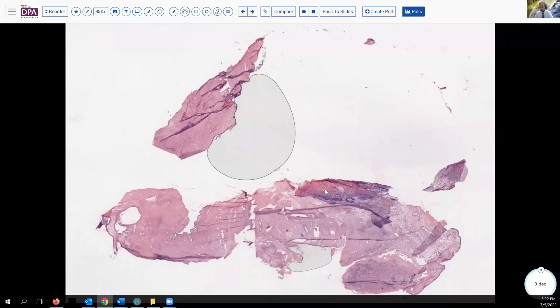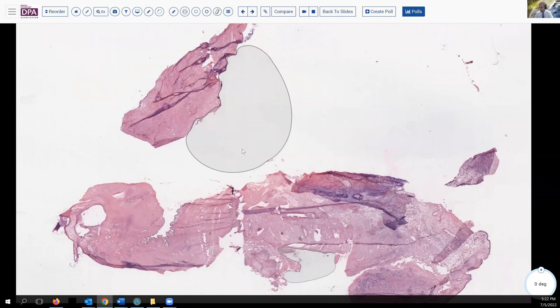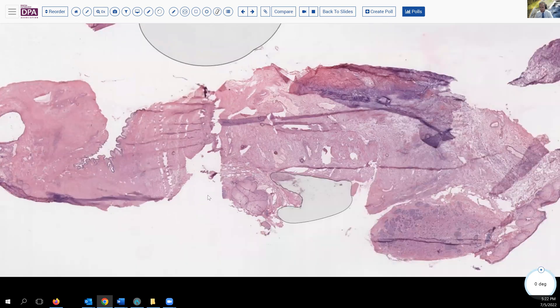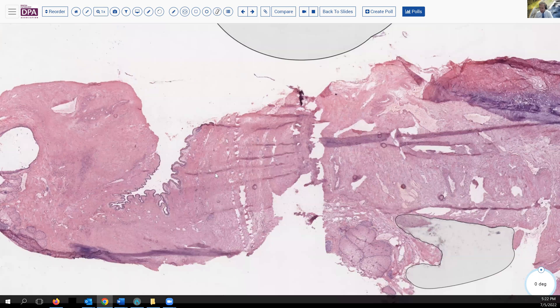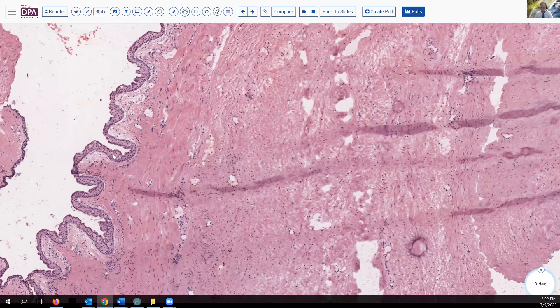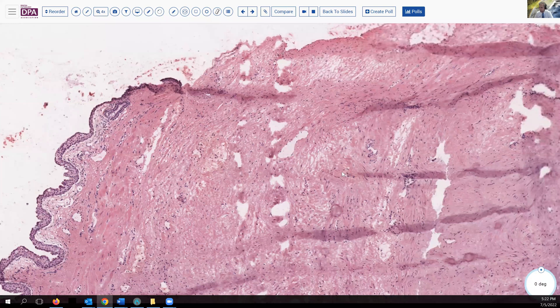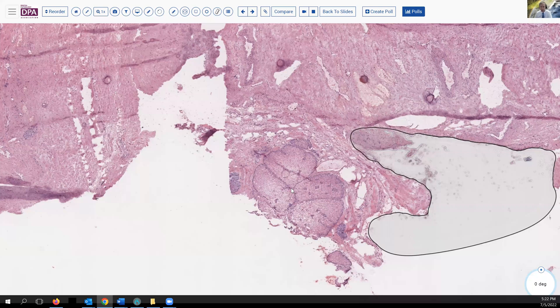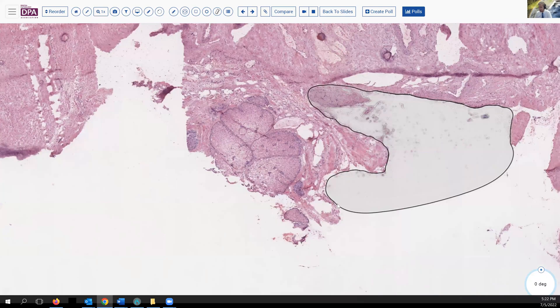Not having a histologic diagnosis, they brought the patient to surgery and submitted this tissue for frozen section. As you can see, we froze and included a couple of little bubbles to make life more interesting. But right off the bat, we said this looks like a teratoma because much of what came out was keratinized debris. That element is seen here — a little squamous stratified type epithelium. Sometimes you get hair, sometimes other structures as well. We had a few sebaceous elements, as you can see here.